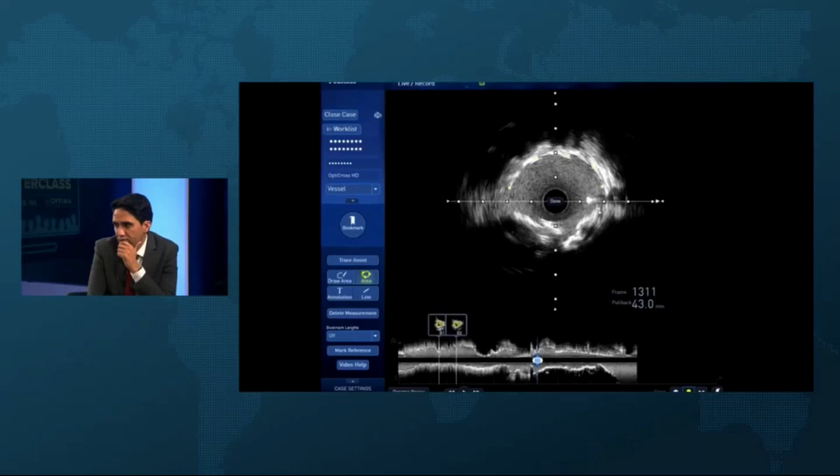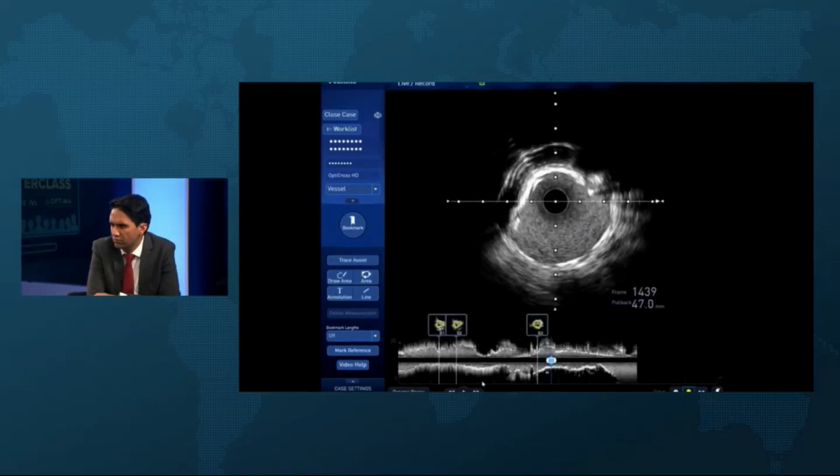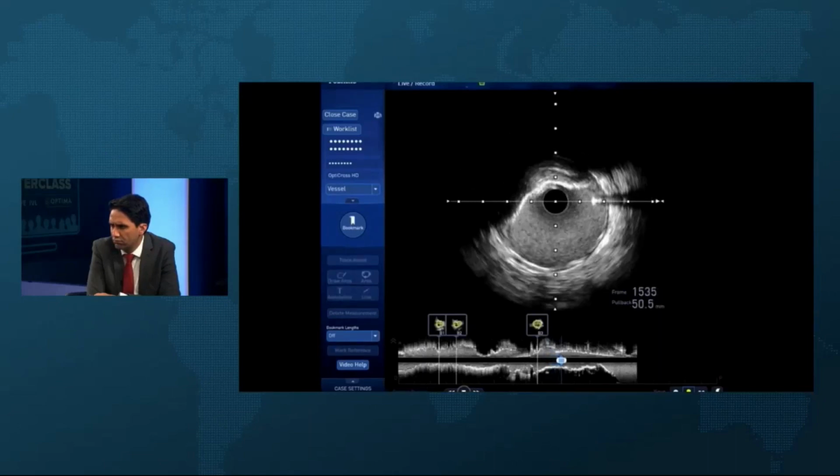Margaret, is there anywhere else you've spotted that needs some post-dilatation? The areas all look quite good. So here's us round about nine, kind of aneurysmal area. Yeah, brilliant, that's nice. I think you can't complain about that. Really just the ostium of the LAD. Let's see what we think about that as we come through.